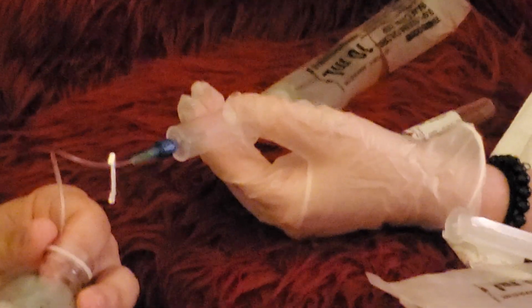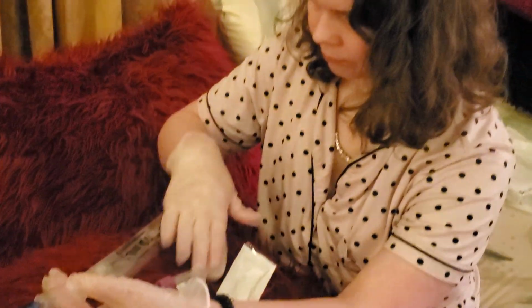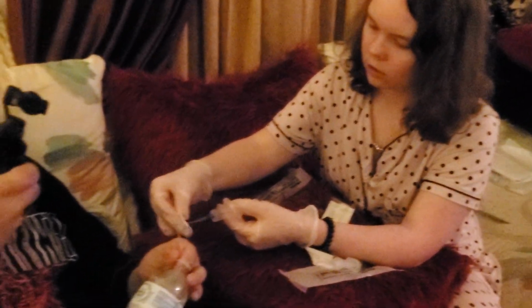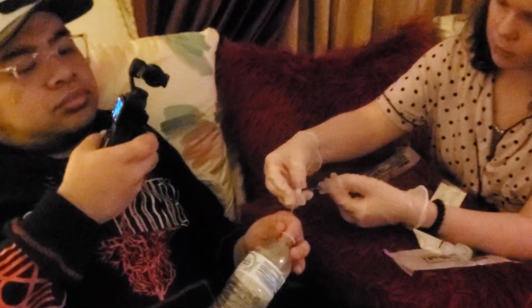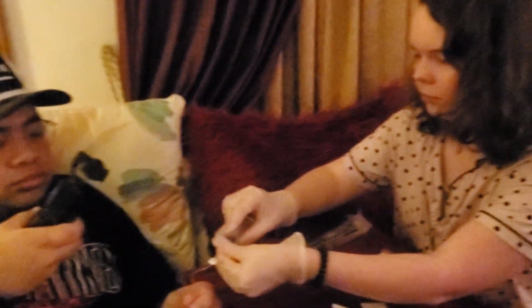I'm going to gently shake to prevent coagulation. Now I need to close this back because I've gotten my blood samples. This goes in the biohazard bag.